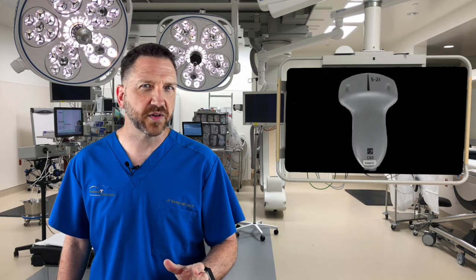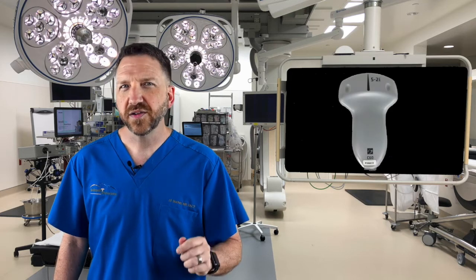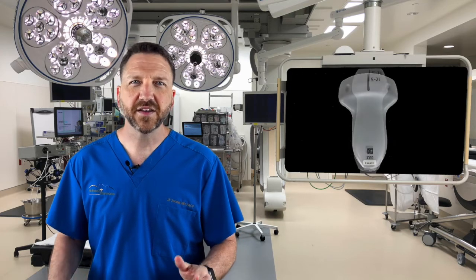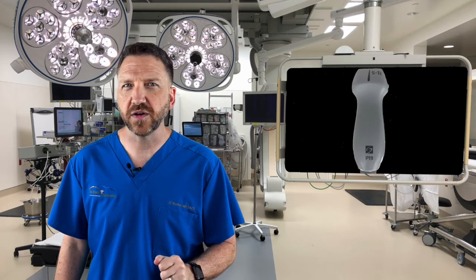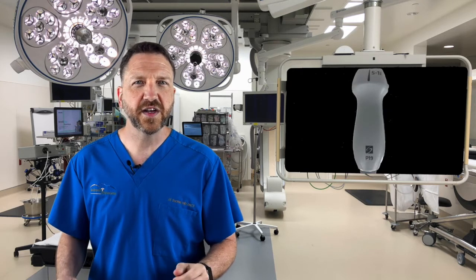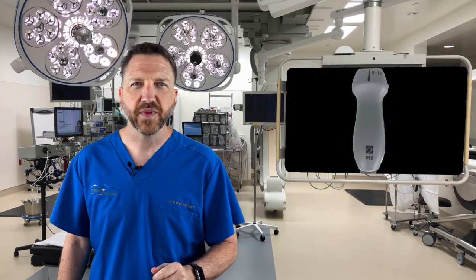The two commonly utilized probes are the curvilinear low-frequency probe, sometimes called the abdominal probe, and the low-footprint phased array probe, sometimes referred to as the cardiac probe. In this video, we'll utilize the cardiac probe.